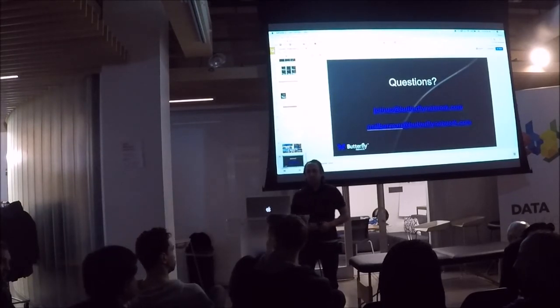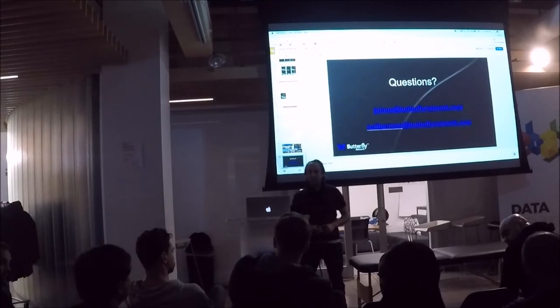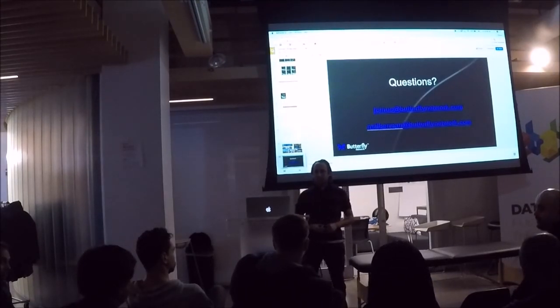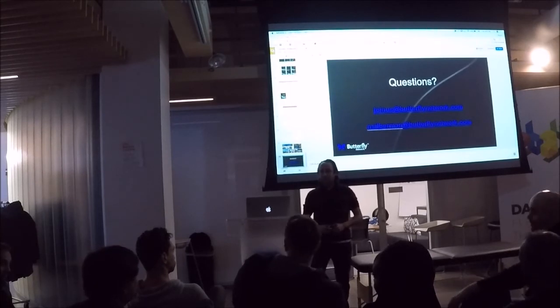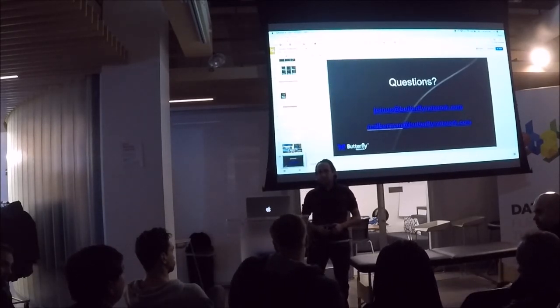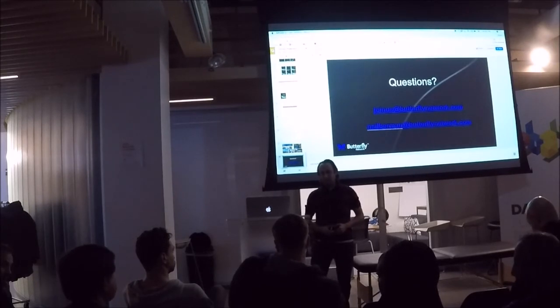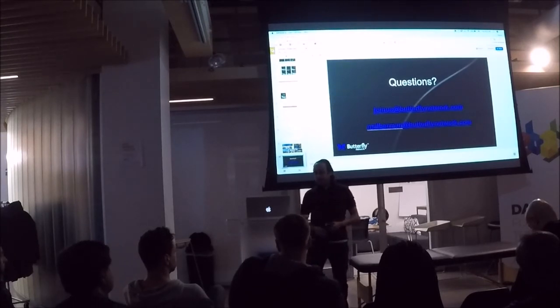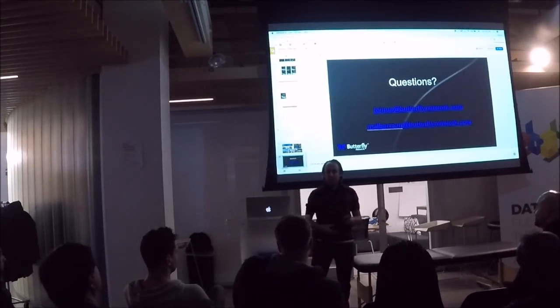I have a two-part question. First, why the iPhone? And second, isn't having it wired, there's some challenges that come with that too? Yeah, those are both excellent questions. The first is most doctors in the US have iPhones.